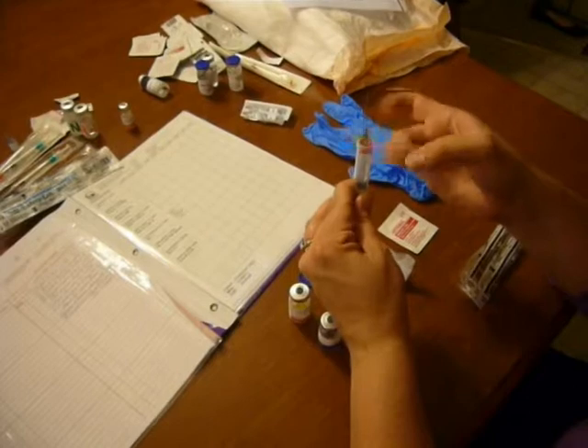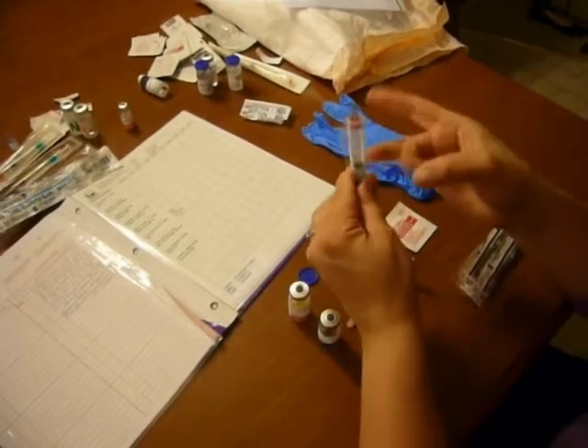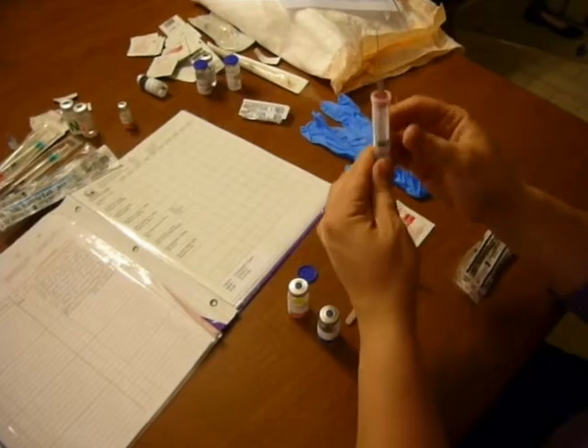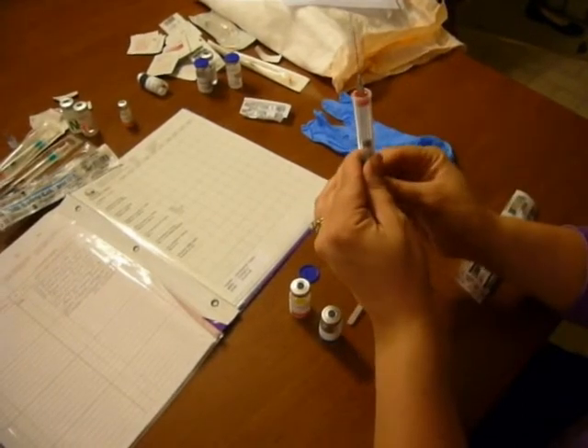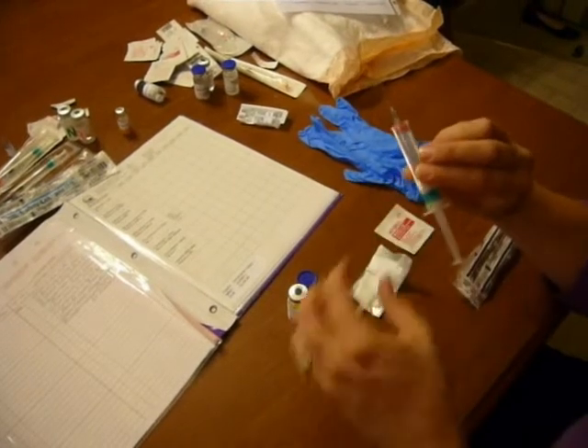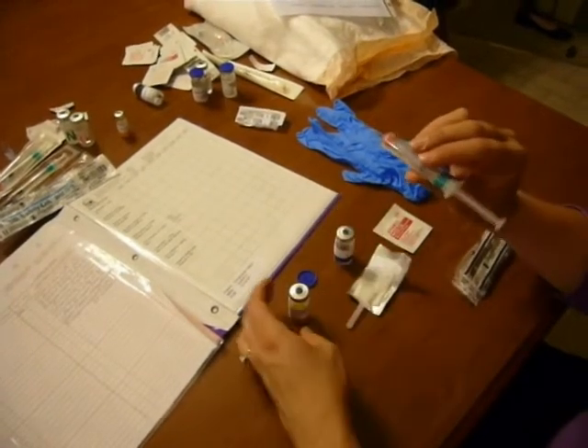Tap all the air bubbles out to the top, making sure they come off the plunger as well. My air bubbles are all at the top, and I'm going to clear it out to make sure I have exactly two cc's of diluent, because I do not want any extra as it would change the concentration of the drug.